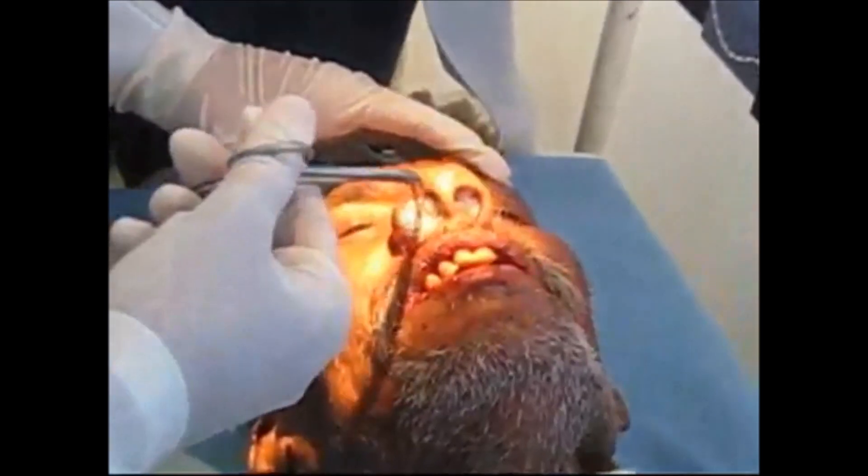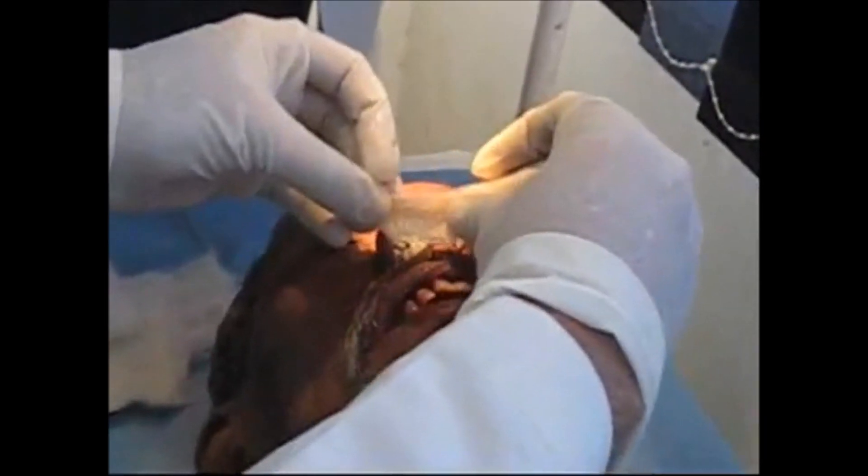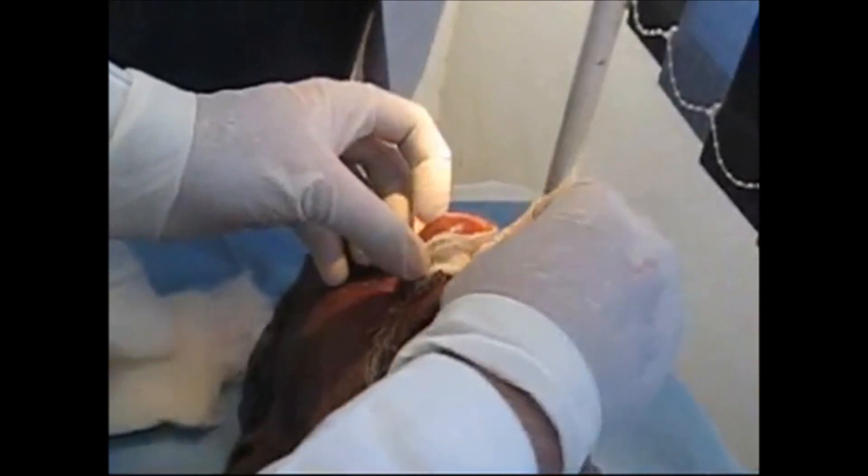After packing, apply the bandage. The bandaging should be done tightly.